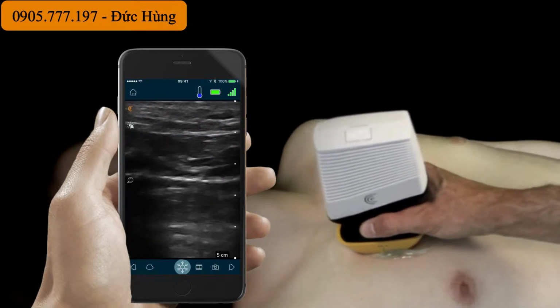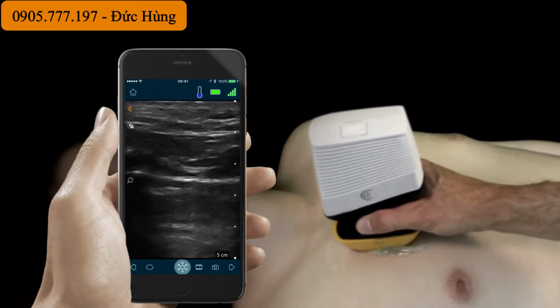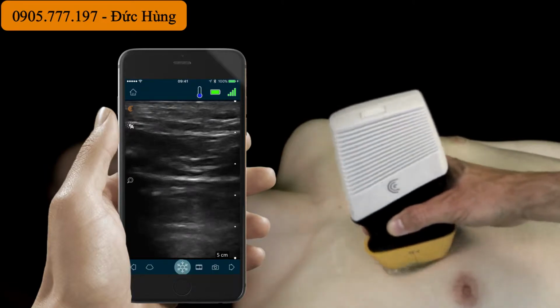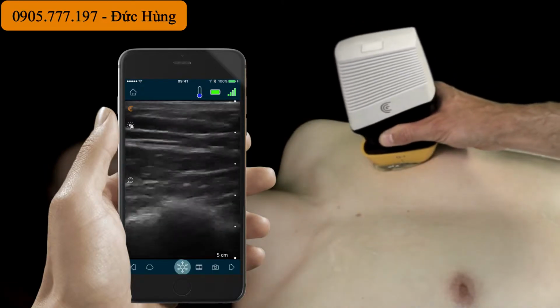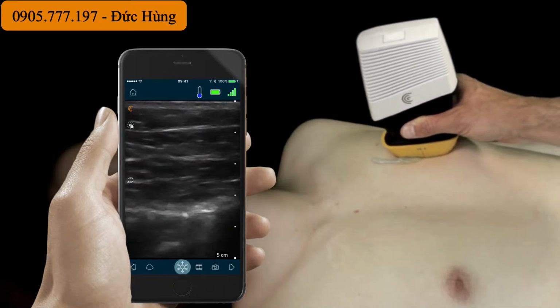superficial to it. Here we can see demonstrated normal lung sliding or shimmering of the two pleural layers sliding on each other, indicating absence of pneumothorax. We can go ahead and move to the contralateral hemithorax and repeat the process.